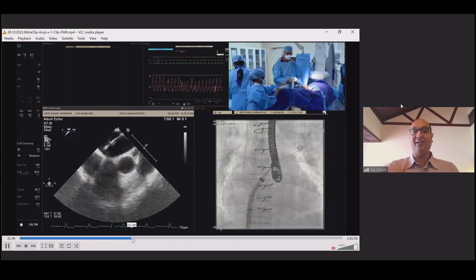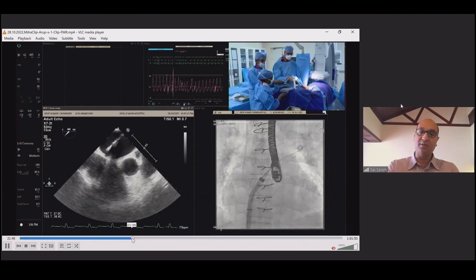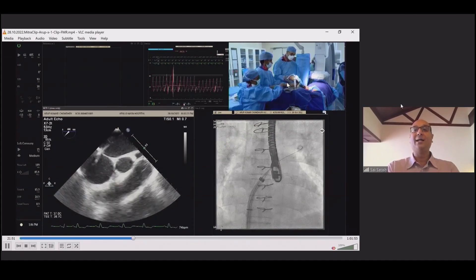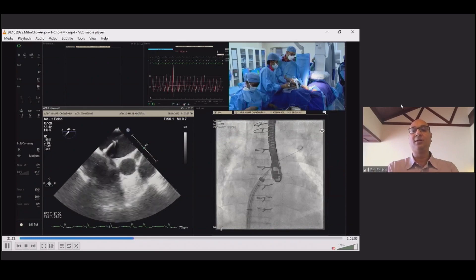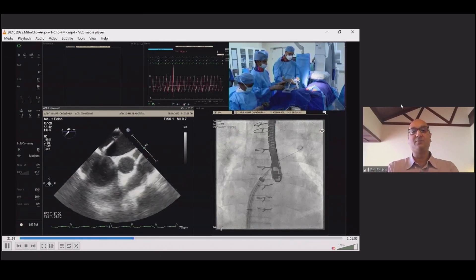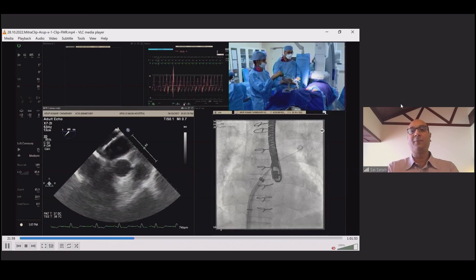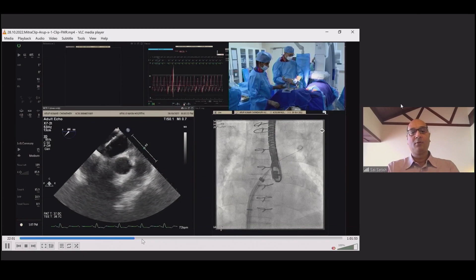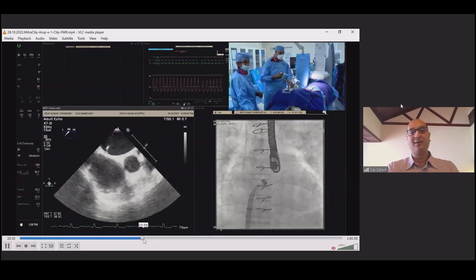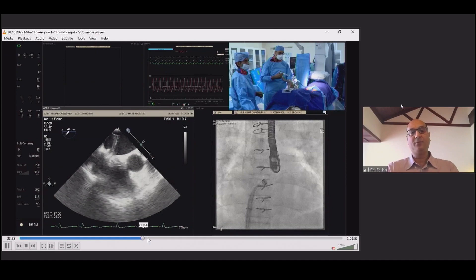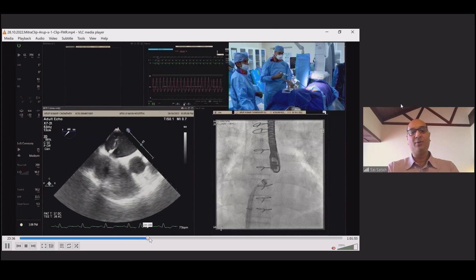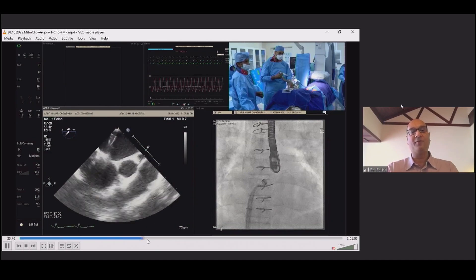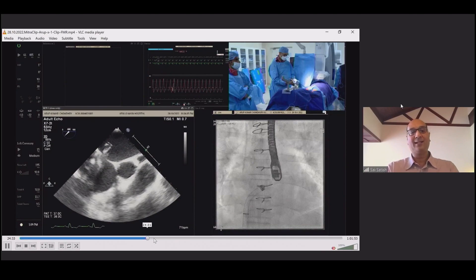Once I pop in, first I take the wire into the dilator — I don't want the super-stiff wire at the valve allowing air in when I take it out. The wire goes into the dilator, then the dilator goes into the guide catheter, then everything comes out. The mounting unit is placed, my guide catheter is mounted on it, all locked in place. The guide is pointing posterior at this point. There was almost 3–3.5 cm of guide in — I like to have about 1.5 cm — so I pull it back.